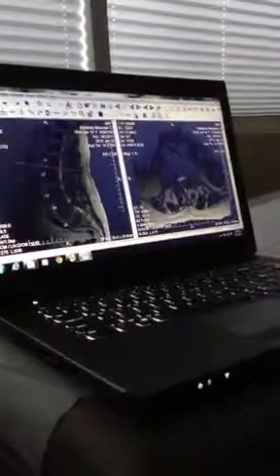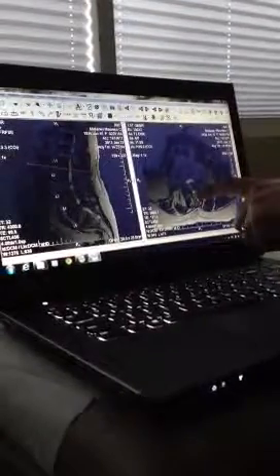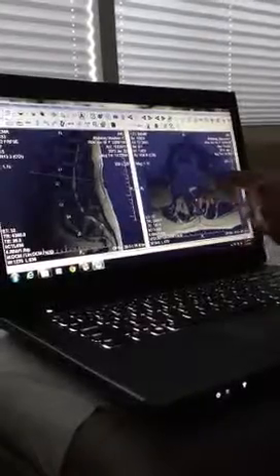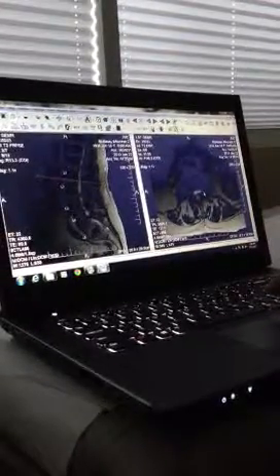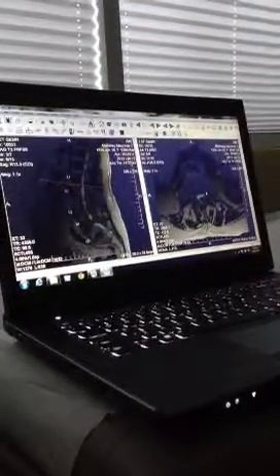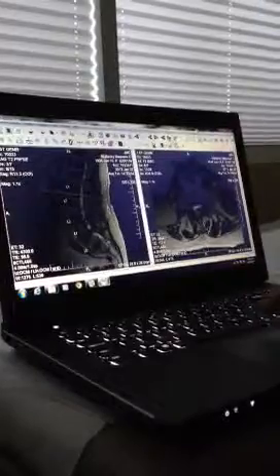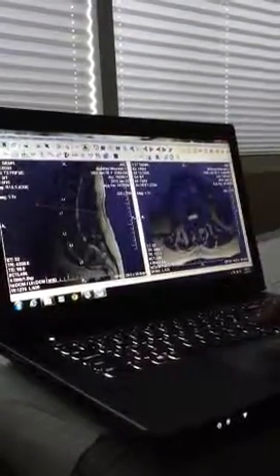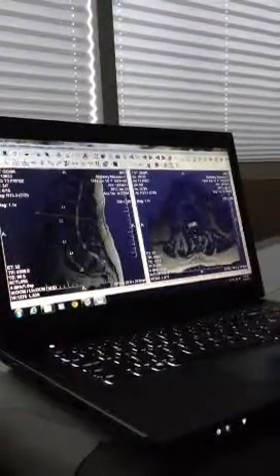Now, if this ligament tends to grow significantly, now we have compression of the spinal canal from this ligament. We have compression of the spinal canal from the overgrown facet joint over here, and compression from the disc herniation. Make sense so far? Pretty much so. I'm trying. Take a look at the ligament back here. Again, we're not at the level of the disc, but the ligament still is there.